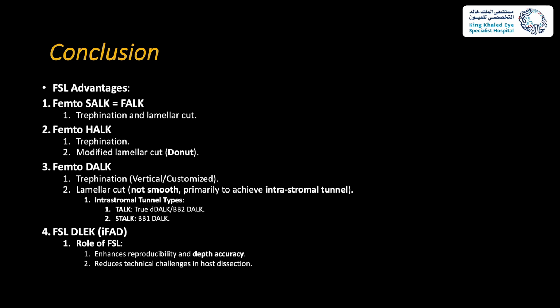In DALK it can give you the compelling benefit of having a customized edge lamellar cut as well as an intrastromal tunnel. DLEK can help with patients who have interface opacities or posterior stromal scar from previous inflammation or infection after DALK.